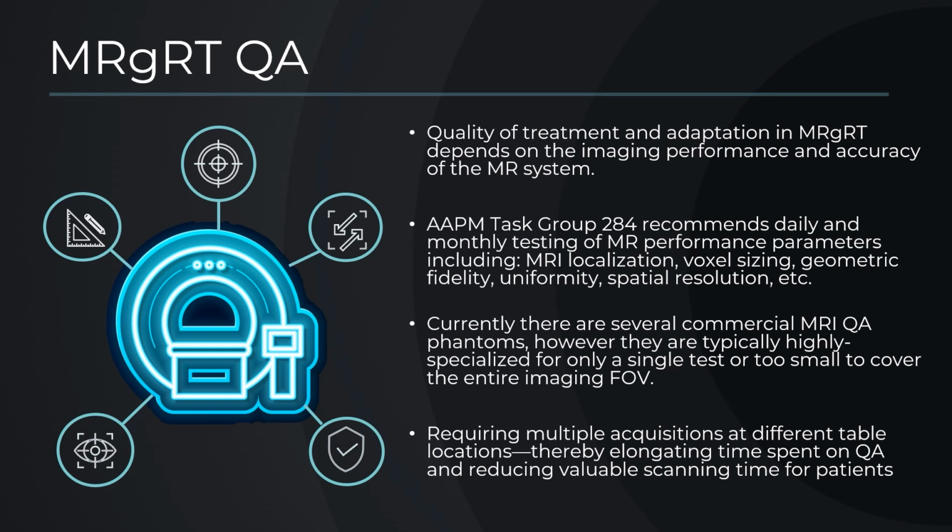And so this will ultimately require the physicist to take multiple acquisitions while consistently moving the phantom around to different locations on the table, all in order to gather one complete dataset, making monthly, let alone daily QA understandably cumbersome, as it takes away valuable scanning time from the patients, but also extends after-hour QA for the physicist.